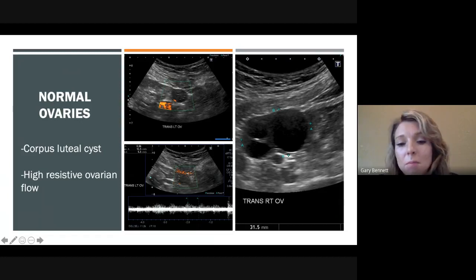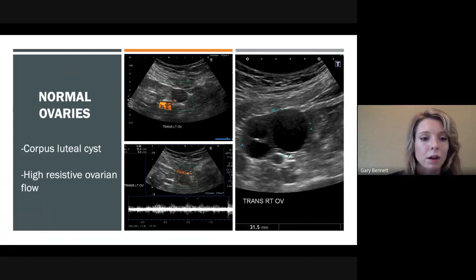Generally, with a pregnant patient, their ovaries aren't going to be super small since they were able to get pregnant. So they're usually a little easier to find transabdominally or endovaginally, as long as the pregnancy hasn't progressed too far to get them squished and moved up. But do keep in mind that they will progress in their location a little bit.